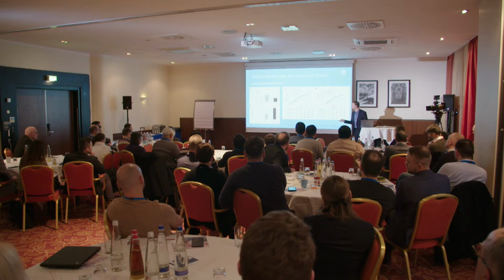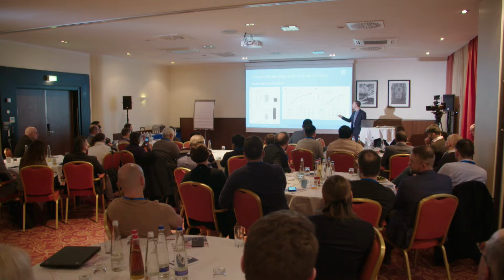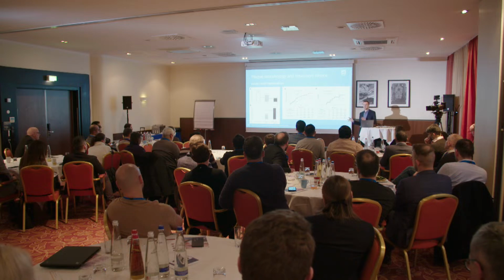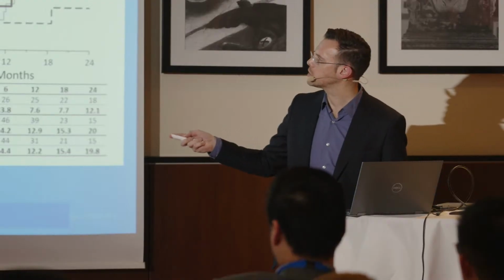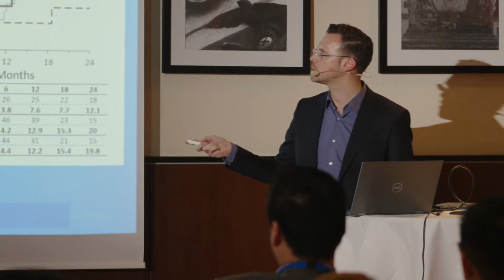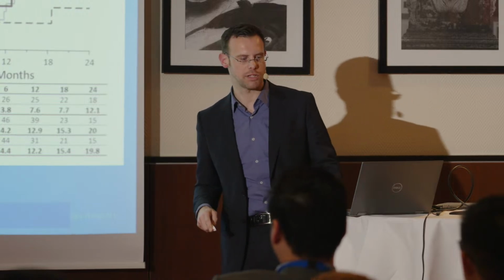Likewise, when deploying a stent, the rate of malapposition of the stent was significantly greater in heavy calcium. So far, less lumen and less accurate stenting in the heavy calcification group. If you think about this in terms of restenosis, it was significantly greater in the calcified groups relative to no calcification, but in this study it did not lead to further re-interventions.